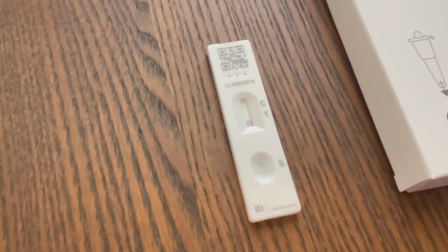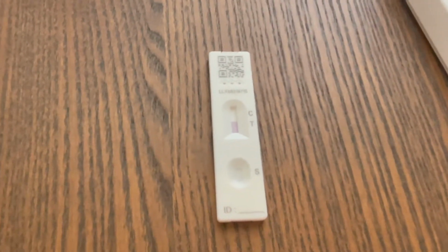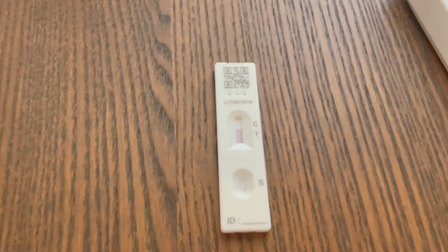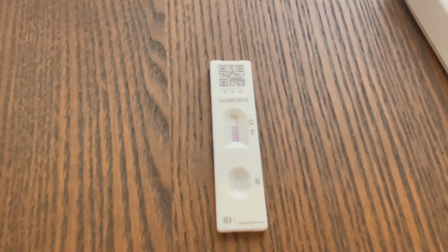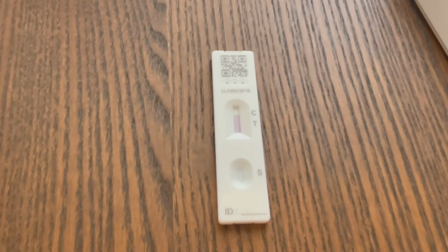Waiting the full 30-minute development time before you read your result is very important. A positive result can appear at any time after 20 minutes. However, you must wait for the full 30 minutes to record a negative test, as the test line, the T, may take this long to appear.